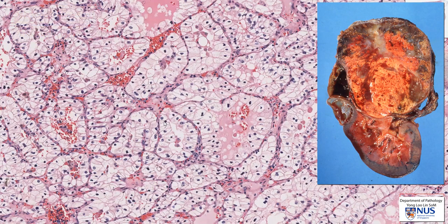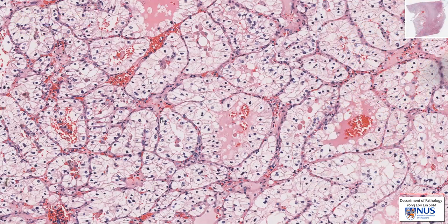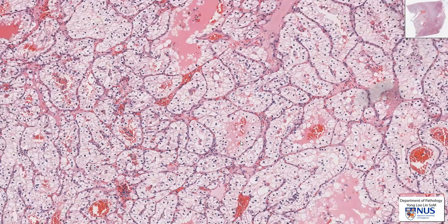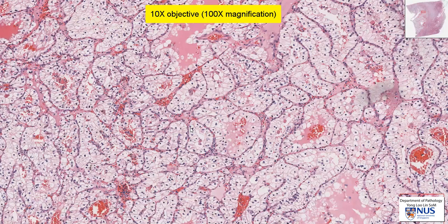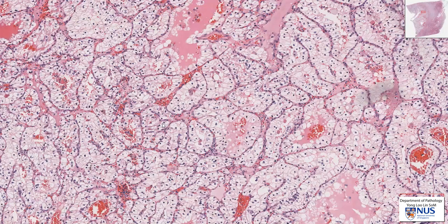Looking at the nuclei, you can see that at this magnification they're not markedly pleomorphic. We usually assess it at roughly 10 times objective view, or 100 times magnification. What I'm going to do is to hunt for nucleoli. If you look at this nucleus, you can just about make out the nucleolus, similarly over here, but it is not prominent at this magnification.